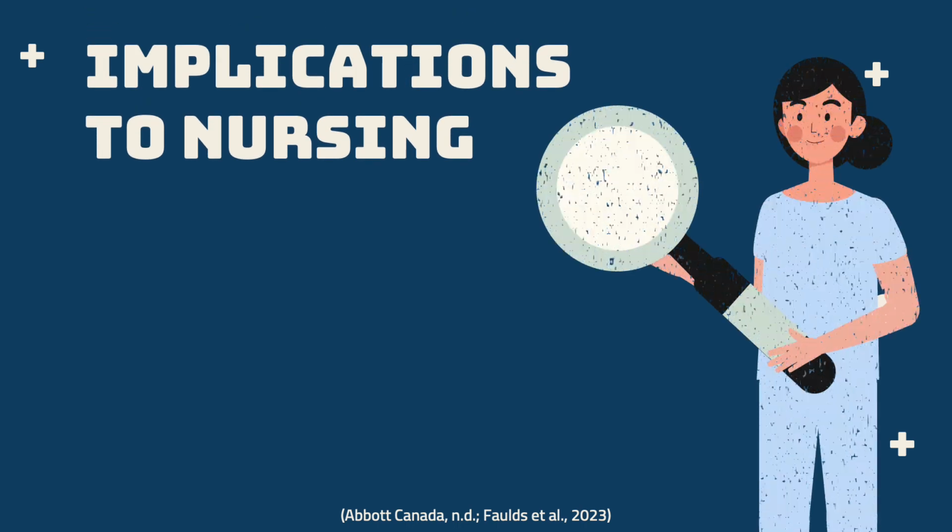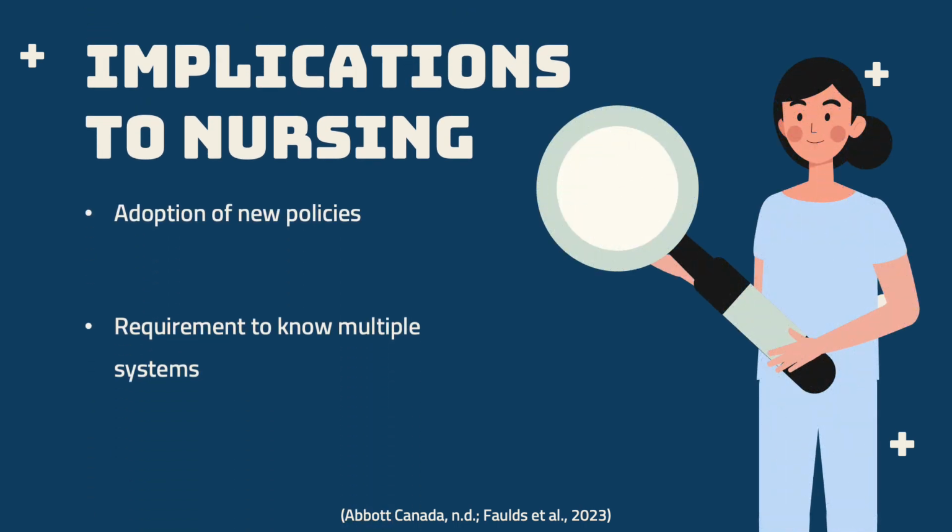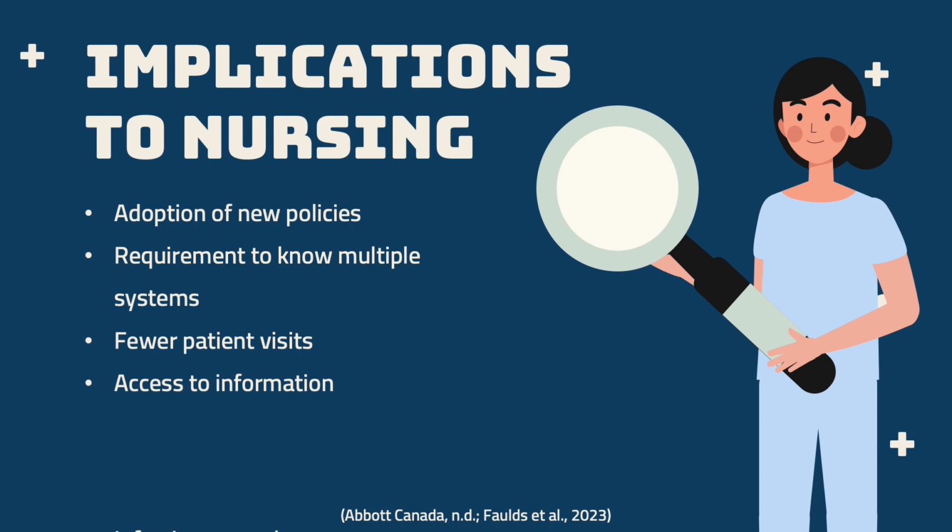The use of continuous glucose monitors has been shown to improve patient health outcomes in both inpatient and primary care settings. In the height of the COVID-19 pandemic, many hospitals shifted to continuous glucose monitoring in their ICU settings to decrease close patient interaction. In a study by Falds and Associates, it was concluded that the continuous glucose monitors were equally as accurate as point-of-care capillary sampling. Their use decreased staff workload, and they reduced the risk of virus transmission.